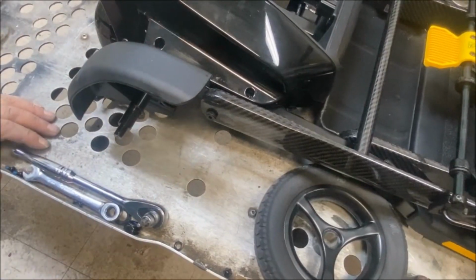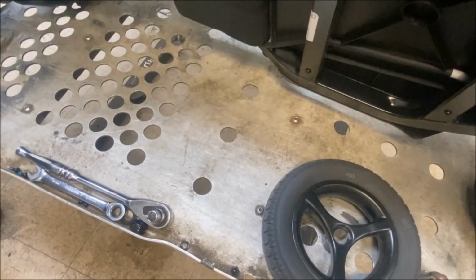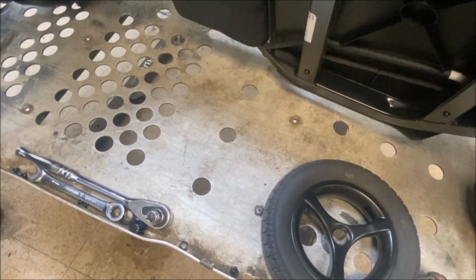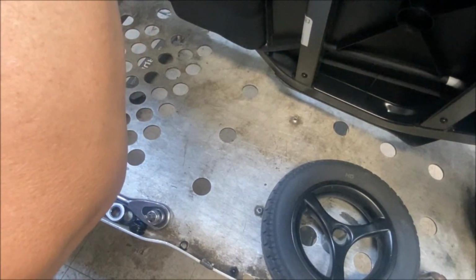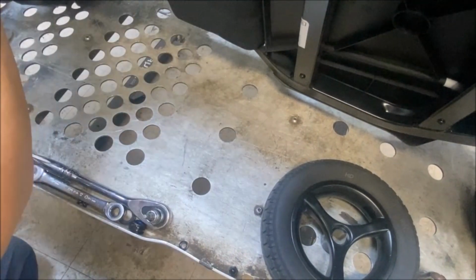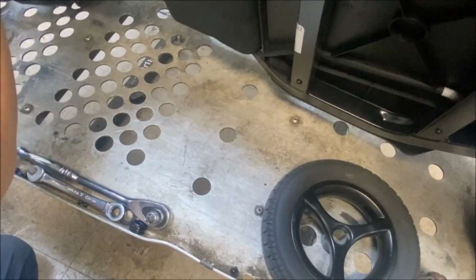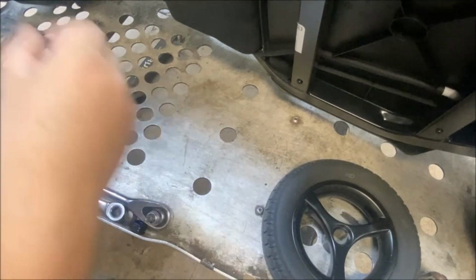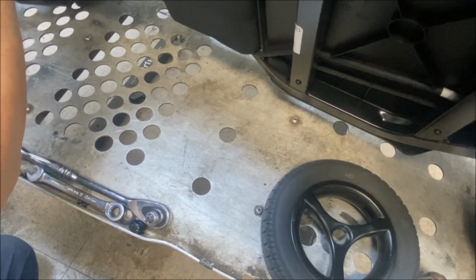Alright, I'll get this side done. Just get this insert put on and the washer and the acorn nut. Popping out the bolt. There we go, so that's located. Washer. Acorn.